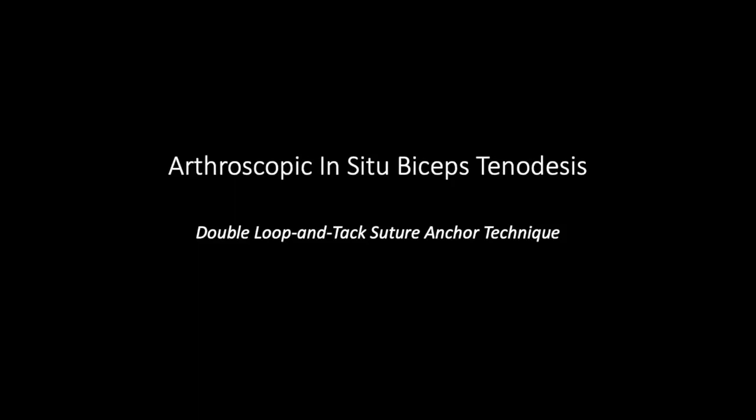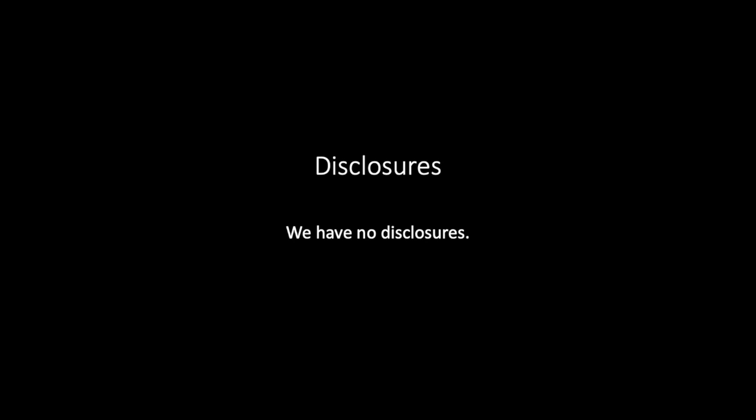This video demonstrates an arthroscopic biceps tenodesis technique using a double loop-and-tack suture anchor. The major advantage of this technique is that it maintains the biceps in its native position and thus its length-tension relationship. We have no disclosures.